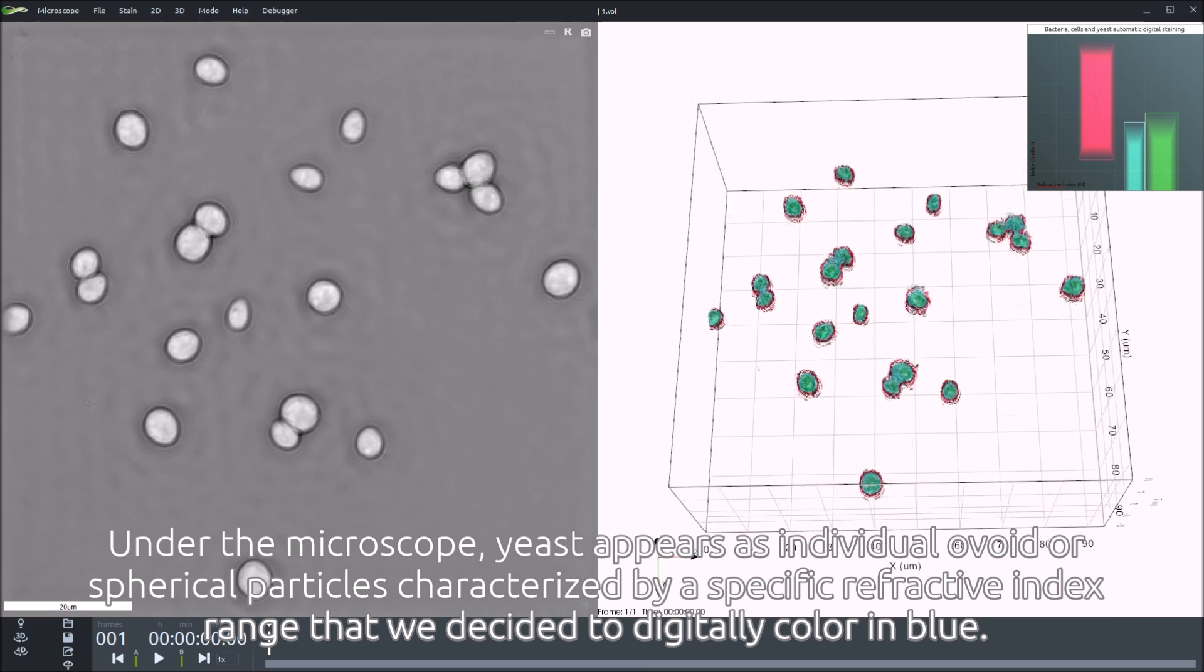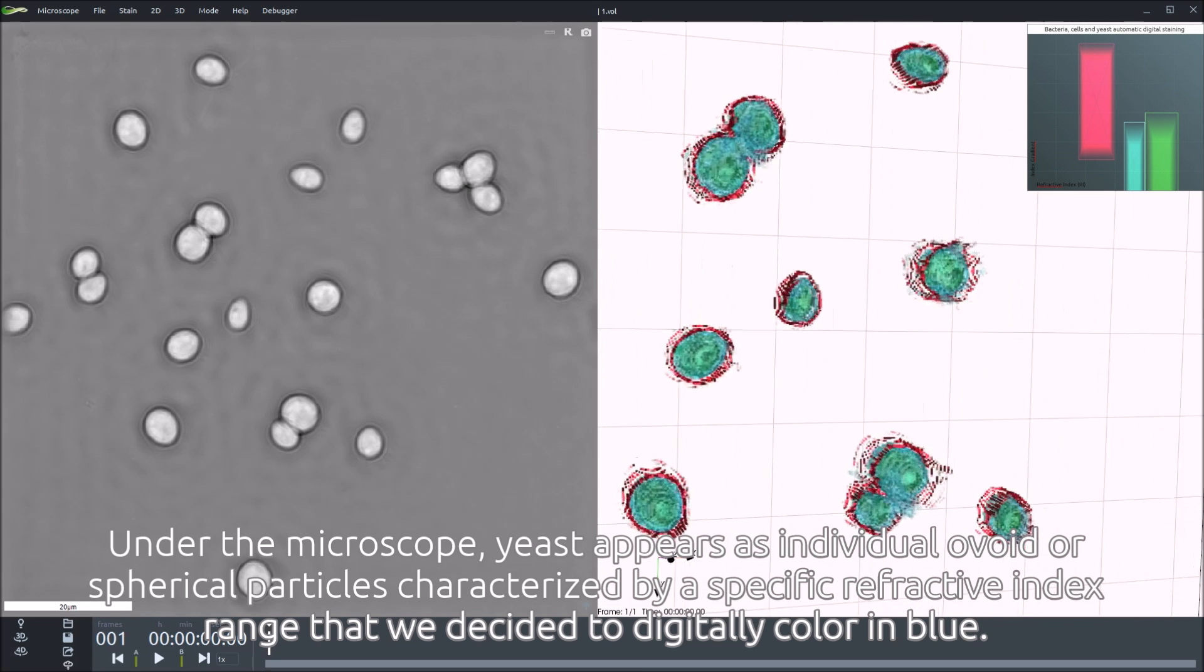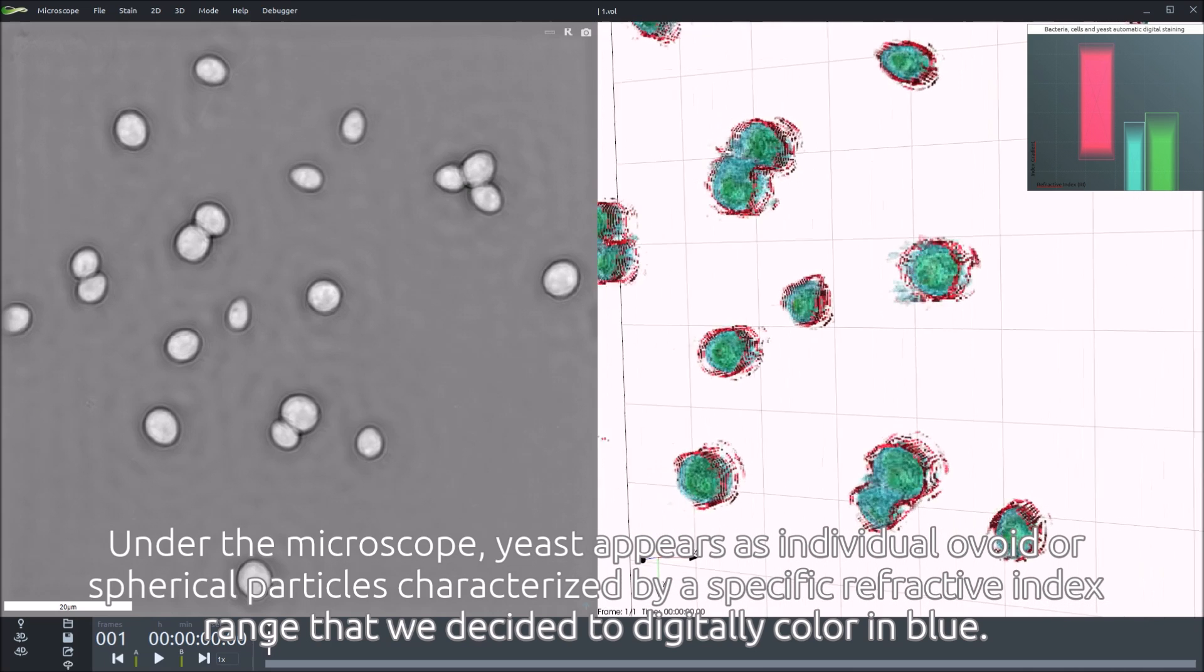Under the microscope, yeast appears as individual ovoid or spherical particles, characterized by a specific refractive index range that we decide to digitally color in blue.